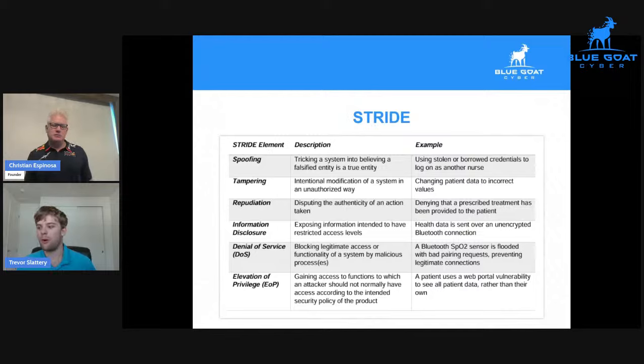Right. And it's especially important with cases like sepsis, where you have such a short amount of time to get accurate treatment. And if you miss that window, you can be in a lot of trouble. So it's really important that especially life-saving devices are kept with really high uptime. They're as close to perfectly reliable as possible. And so there is not much that takes them offline. So identifying a problem that can just cut out the functionality of a device can be a pretty big deal.